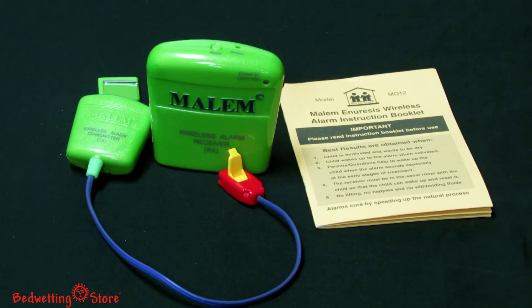The innovative Malem wireless bedwetting alarm comes with one receiver or two, a transmitter, the easy clip sensor, an instruction manual, and a progress chart with success stickers.